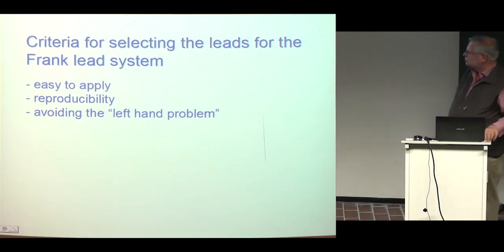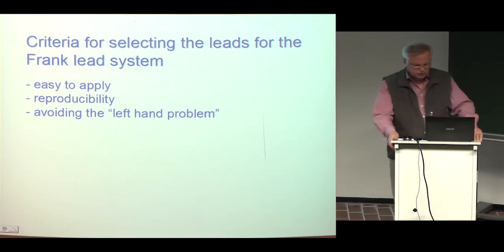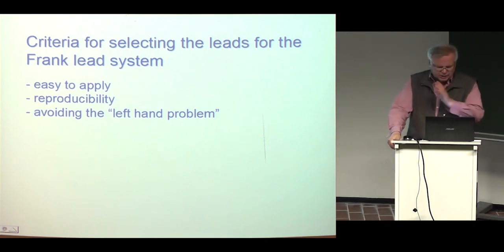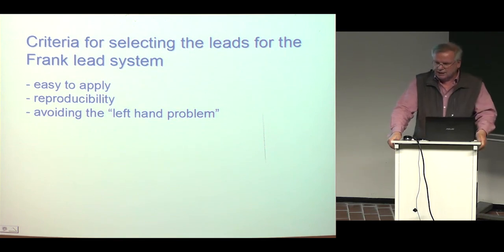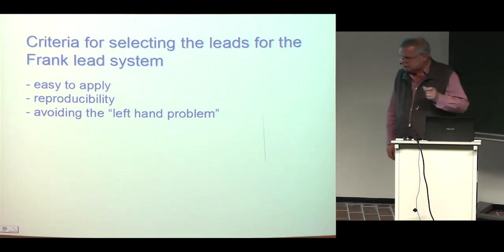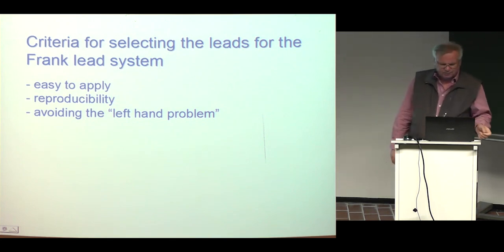Frank was a cardiologist by education. He was a smart and technically oriented cardiologist, but he was not an engineer, he was a cardiologist. And that was a great benefit in Frank's lead system. The criteria which he had in designing the lead system was that it should be easy to apply. Of course, that saves a lot of time in clinical work. It should have good reproducibility.